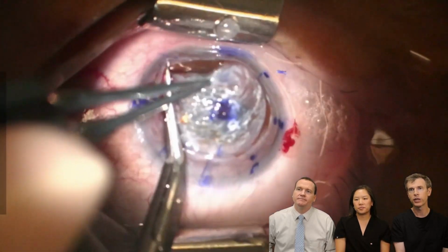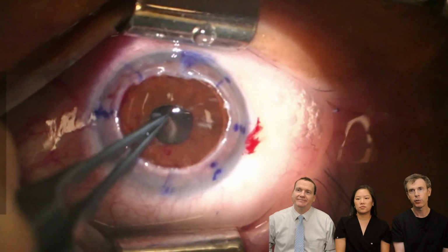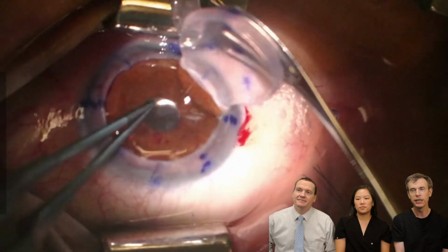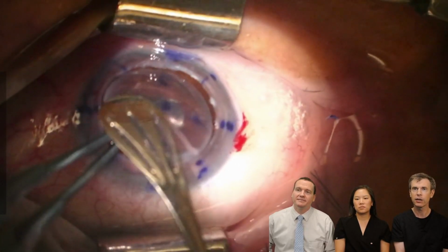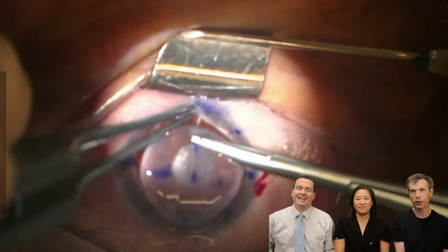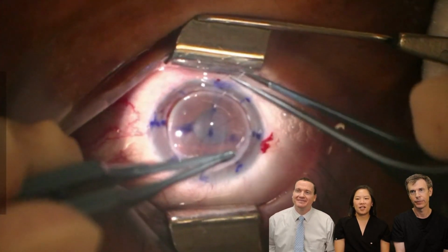This is the peripheral change. You see a little bit of bleeding. That was some neovascularization in there. This never makes us happy when the lens tries to come out of the eye, because then our blood pressure goes up, and we try to move along very quickly. Not quite as quickly as sped up, but getting the cornea on is paramount, which is why we don't like open eyes and full thickness transplants. And by we, I mean particularly I don't like them. Partial thickness is always better. Yes. I like watching them. It feels a lot safer.